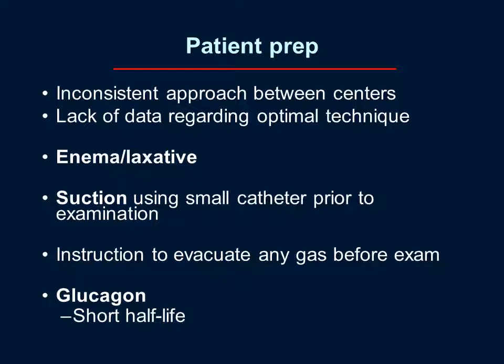At our center we routinely give the patient instructions before the exam to evacuate and try to empty their rectum. We tell the patients it will help us get clearer images. And also glucagon can be used to reduce any peristalsis, although this has a short half-life and may not last throughout the entire exam.